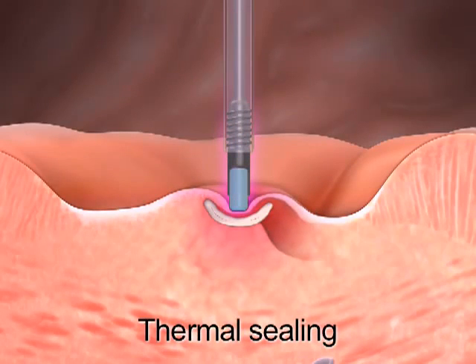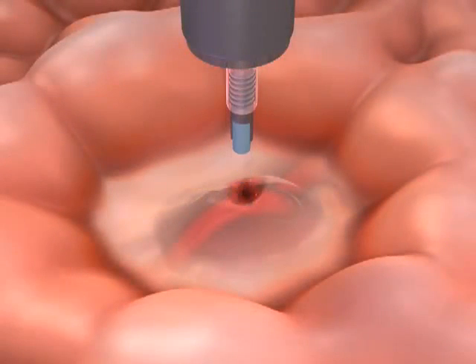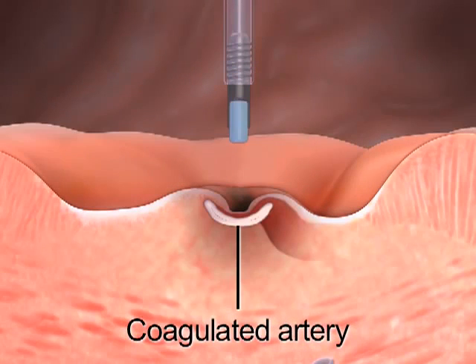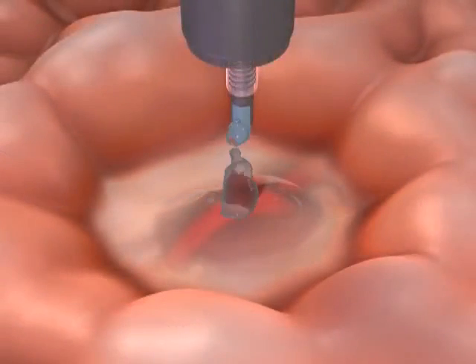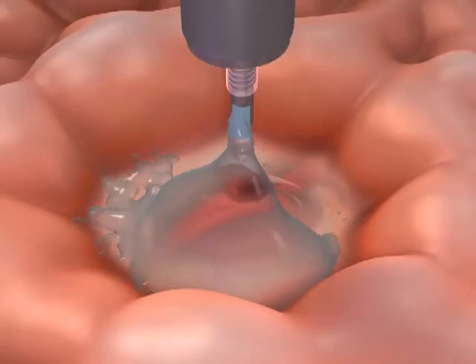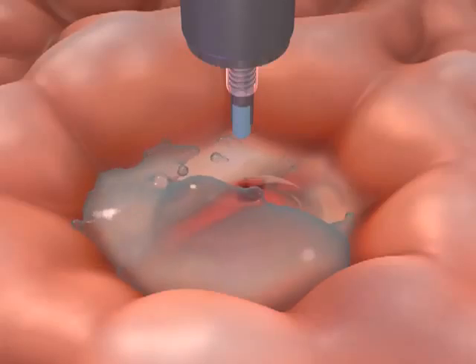Treatment should continue until the active bleeding has stopped, or the protuberance of the non-bleeding visible vessel has been completely flattened. The endoscopist should observe a post-hemostasis depression or footprint on completion of the contact thermal therapy, confirming the approximation and fusion of the superficial tissue layers and the deeper tissue layers. This area then should be irrigated with water through the contact thermal probe and observed for any possible post-treatment bleeding.